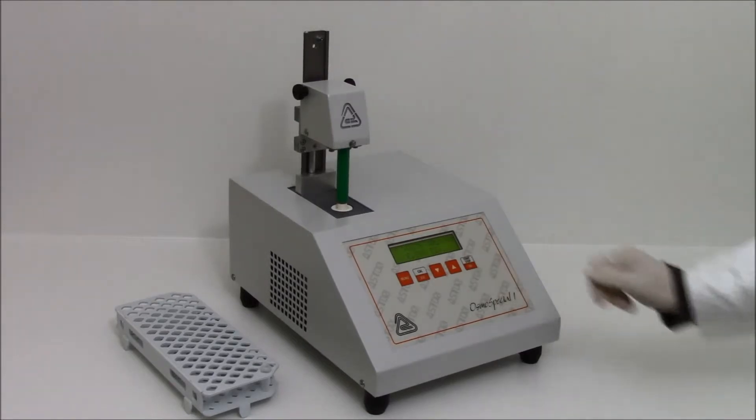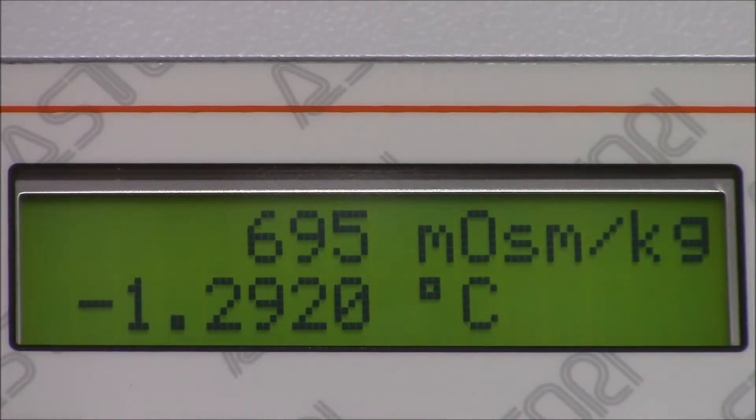Press the start key. The equipment will automatically carry out the measurement and an acoustic alarm indicates that the analysis has completed.